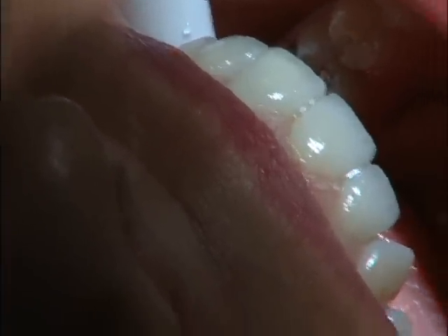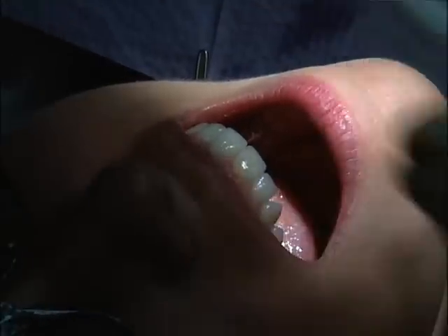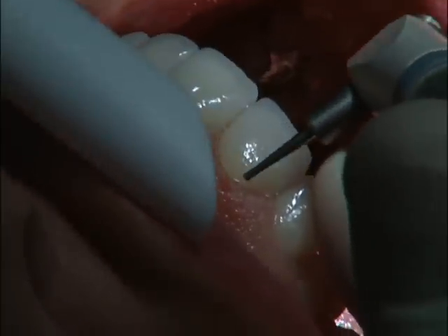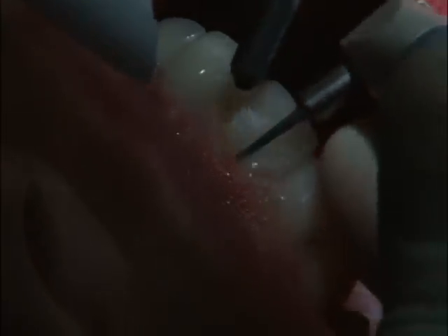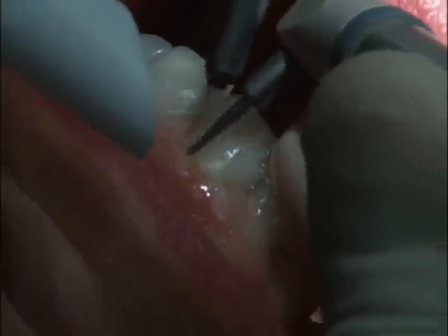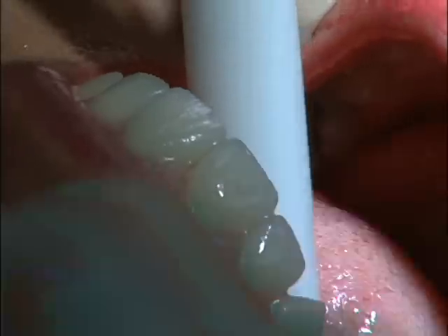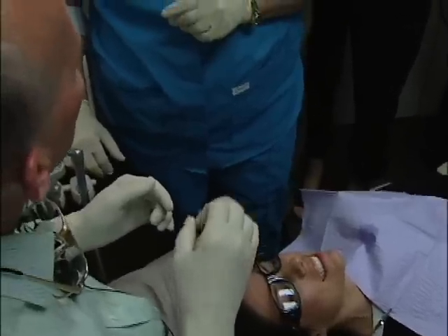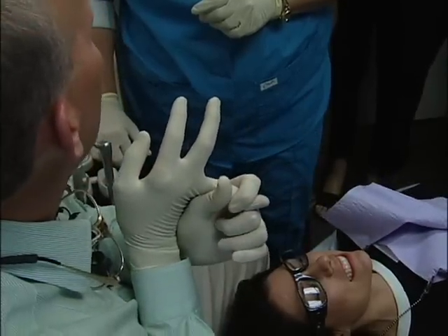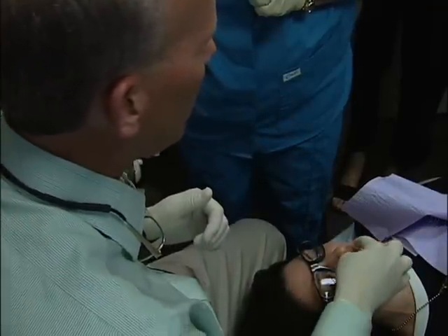A little bit of water on that, and you just clean it off. I'm going to touch one more spot here, Janice, and then I'm done. A little bit of water helps that. The tissue now looks a little bit whitish and reddish. I'm going to show you a case that we did this afternoon where we took a tooth out and lasered the tissue. I have a 24-hour post-op and a one-week post-op. In 24 hours it's a little reddish looking, and in one week it's perfectly normal — absolutely beautiful looking. So this is now going to heal underneath that very rapidly.